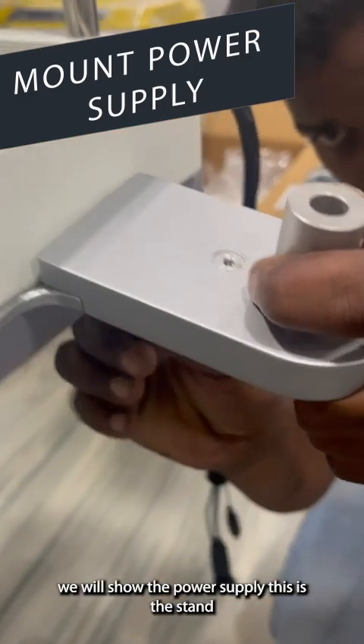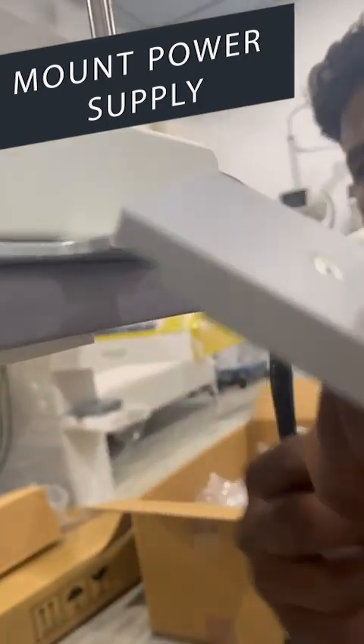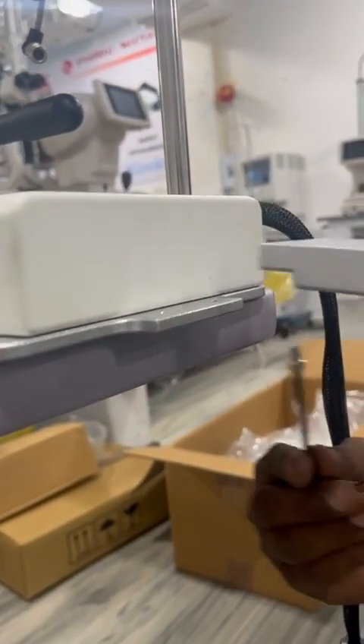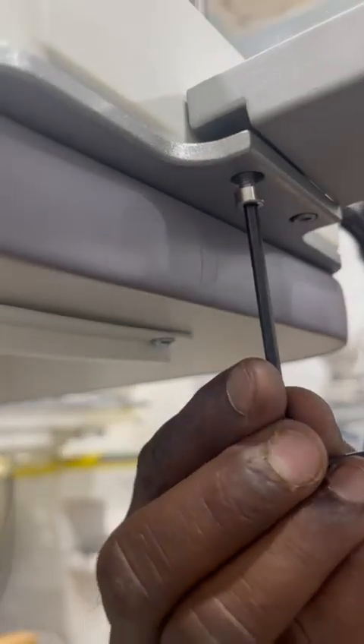Now we will install the power supply. This is the stand, and this is the power supply.